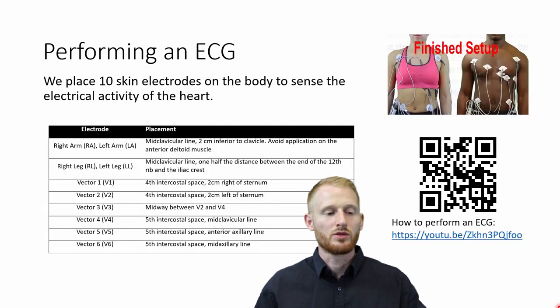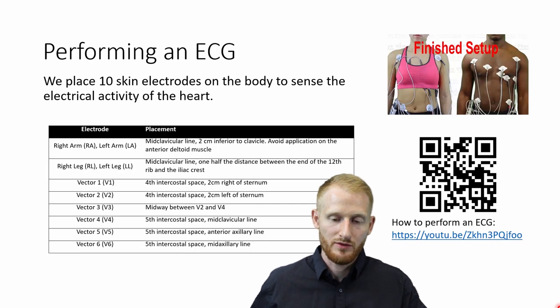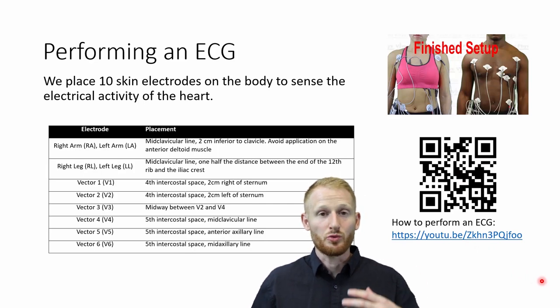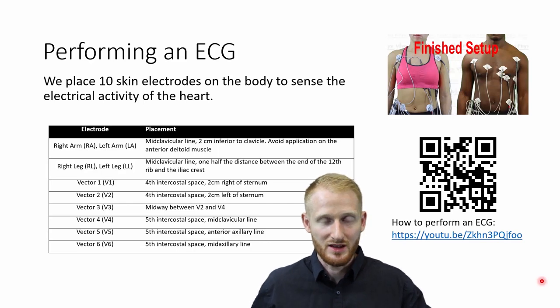Now, how do you perform an ECG? We're not going to cover this in detail here. If you want to know how to actually do the ECG and set up and apply all these electrodes, you should scan this QR code or go to this link here, and it'll take you to a video where I talk about how to apply the electrodes, where those electrodes go, in order to get the person set up and ready for the machine to actually do the work.